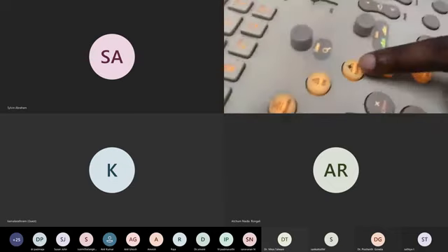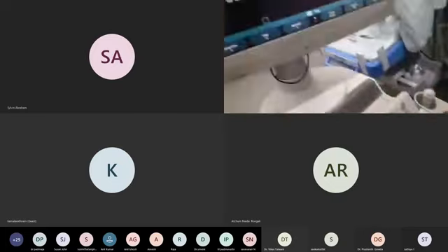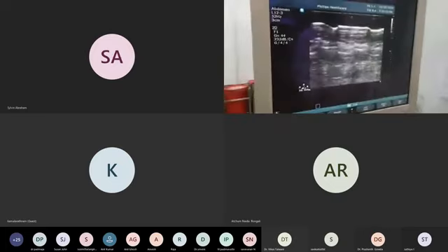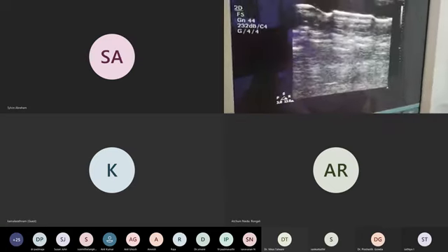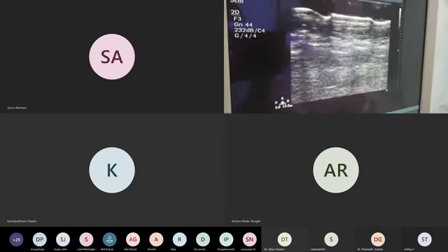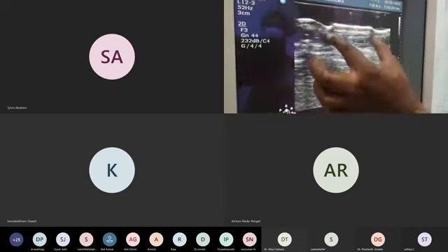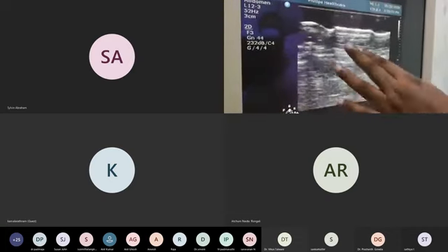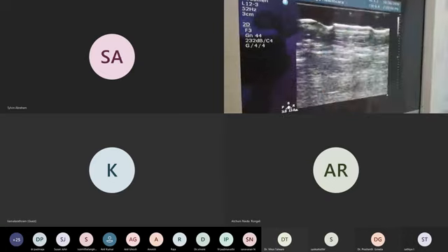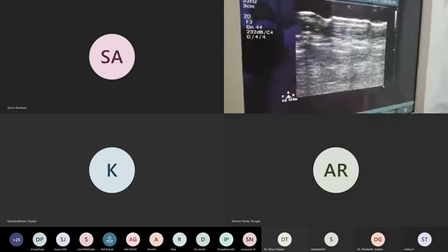Fusion. Can you focus with this? Just keep on pressing. Okay, see, now everywhere, almost in the center, it is coming very good. But this corner won't be good. But we are focusing on this. This is very important. Fusion, tissue harmonic image is very important.